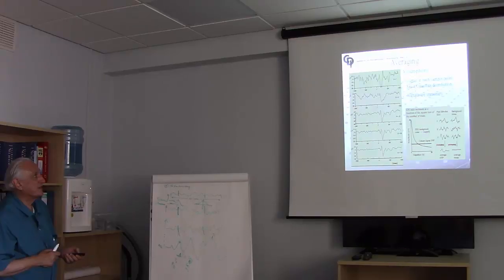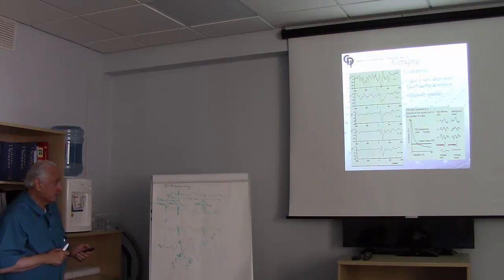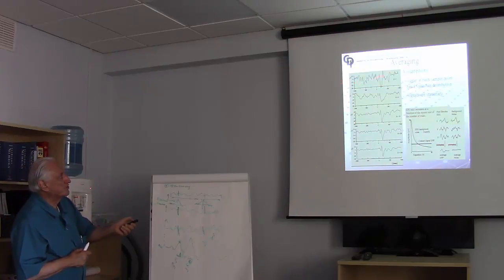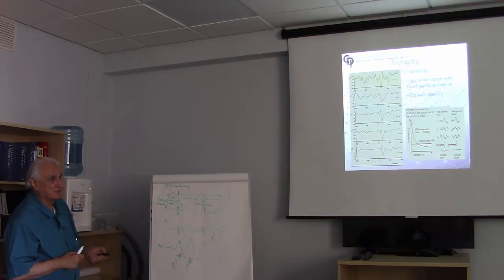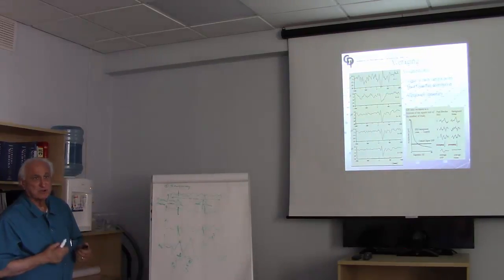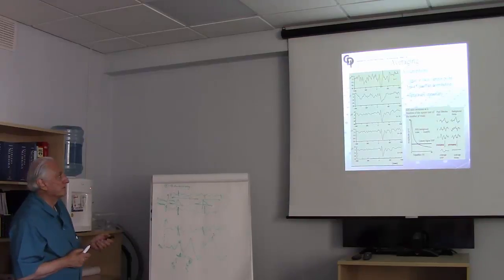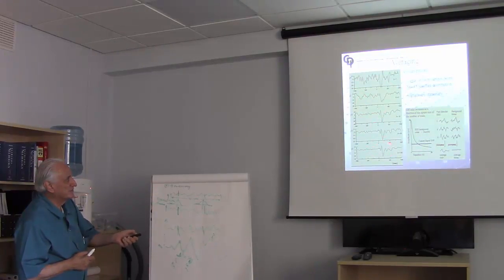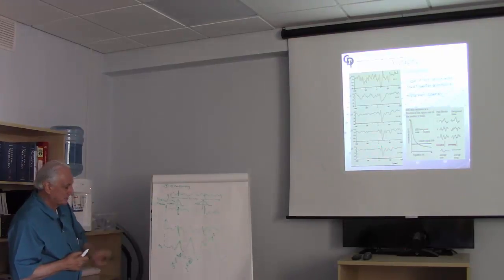So just to reinforce the averaging idea, this is one trace. The assumption is that the signal at each sample point has a Gaussian distribution and the signals are stationary. These are really the assumptions that drive this thing, so they're strong assumptions. In this particular case, you can see there are several signals being averaged, and you eventually get down to where you've extracted whatever the signal is.